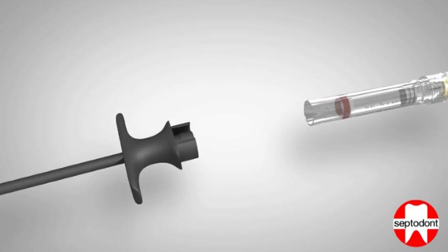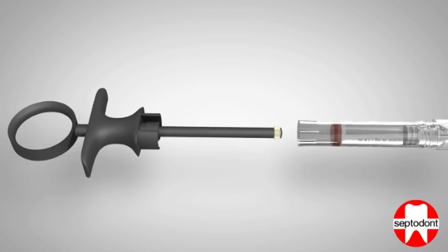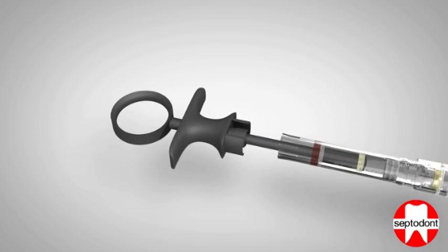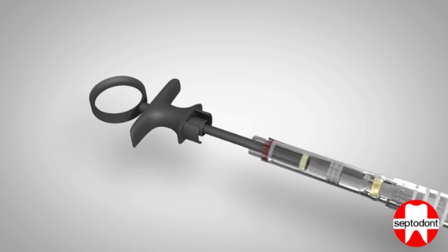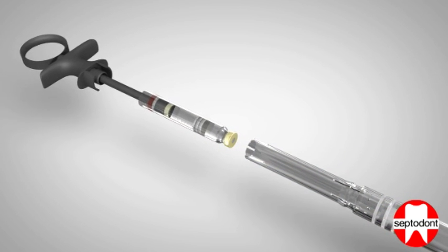At this point, separate the handle from the syringe body and extend the tip of the plunger. Now partially insert the tip of the plunger into the open end of the cartridge, and then withdraw the plunger with cartridge attached from the device.